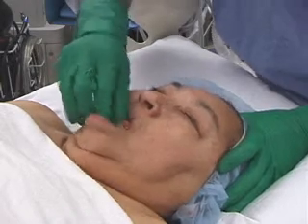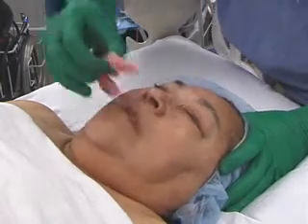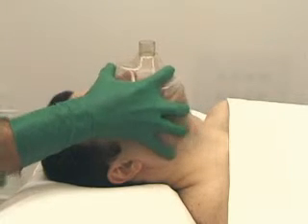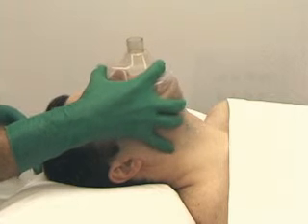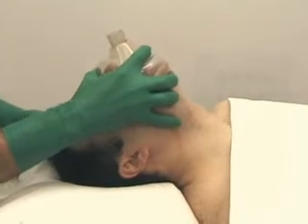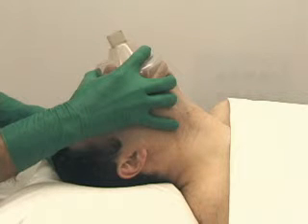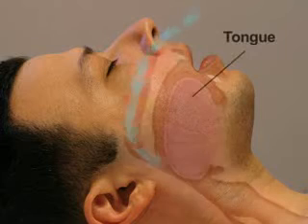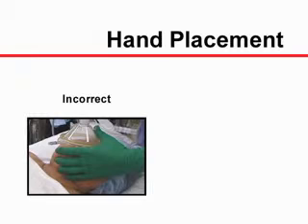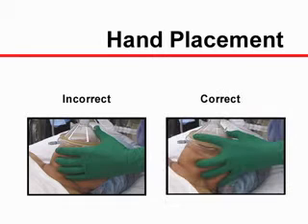One may consider leaving full dentures in place to provide a better mask seal. The most common method to hold the mask consists of placing the thumb and index finger on the body of the mask while the other fingers pull the jaw forward and extend the head. The middle and ring finger are placed on the ridge of the mandible and the fifth finger is placed behind the angle of the mandible. The tongue is the most common cause of airway obstruction. It is important to minimize the pressure applied to the submandibular soft tissues, as this may further obstruct the airway by pushing the tongue against the palate.